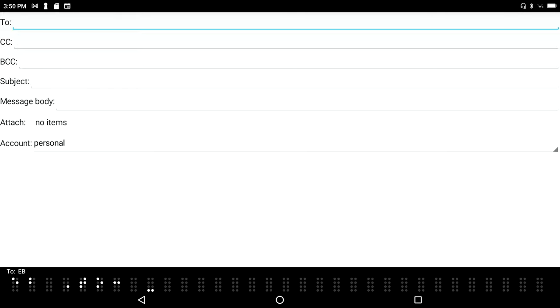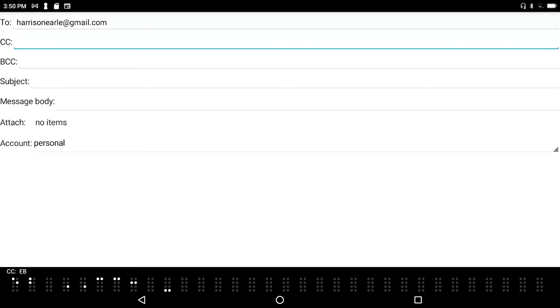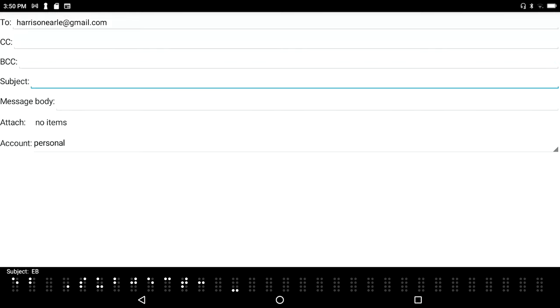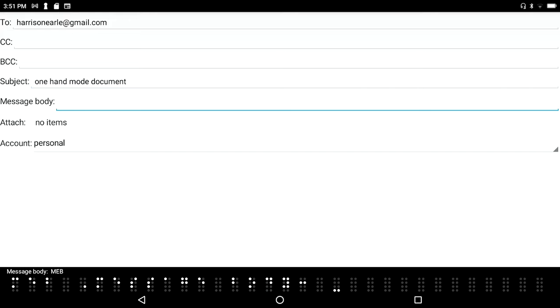Now let's just send this to myself. I type harrisonearle@gmail.com, then I'm going to tab to the subject field, past the CC and BCC fields, and type in 'one hand mode document'.